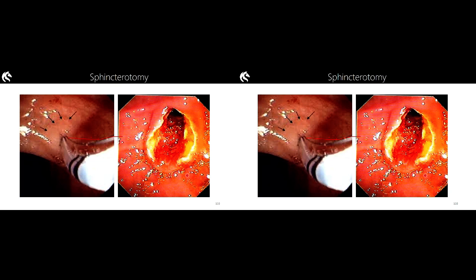By virtue of the fact that it's a heated wire, it's going to cauterize, so seal off those tissues as they occur. So long as they don't hit an artery or vein, that's what they get for the rest of their life. The size doesn't matter too much, they can cut 12 or so. The limiting factor is, if you can see following the line across here, that little bulge of tissue.